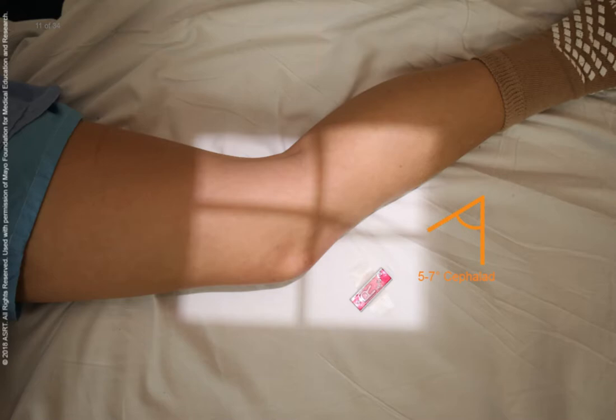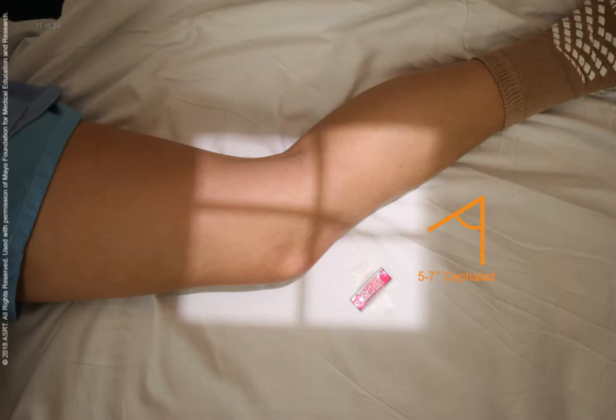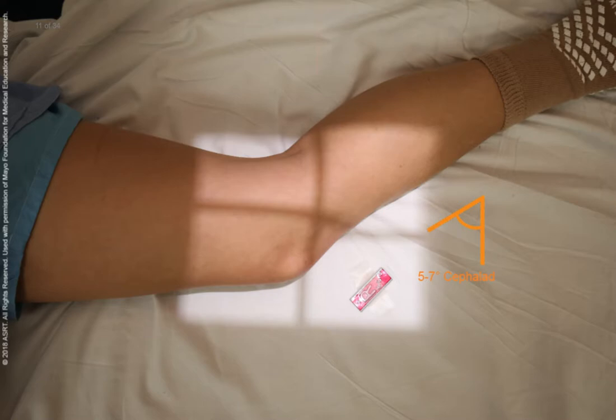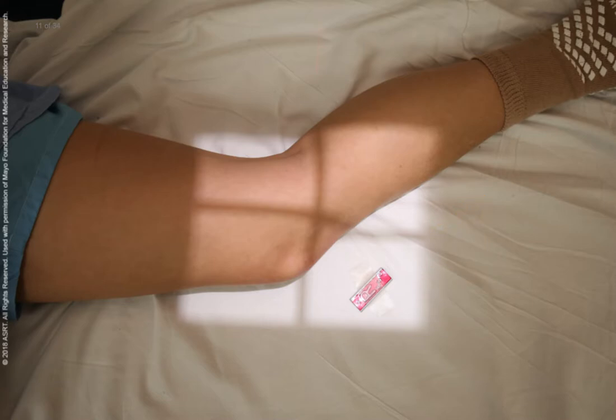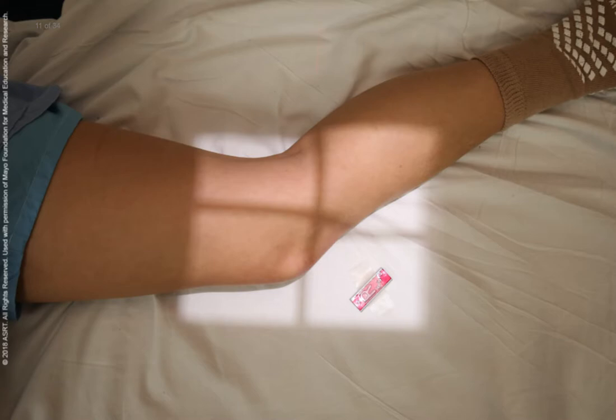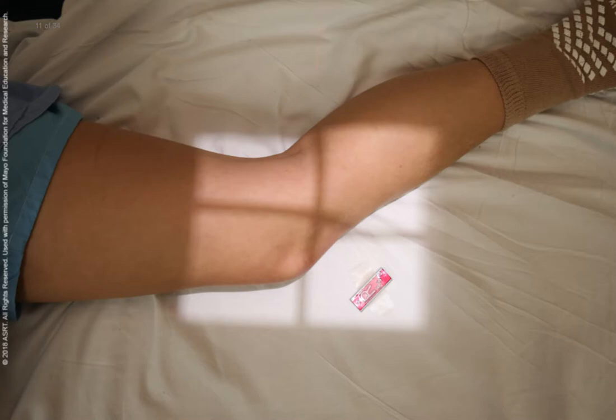The small cephalad angle is used to prevent the magnified image of the medial femoral condyle from obscuring the joint space. Also, the medial condyle lies slightly inferior to the lateral condyle when the patient is in a lateral recumbent position. Make sure the image receptor is centered to the central ray. Anatomical markers are placed on the image receptor to identify the anatomical side being examined. The patient's gonads are shielded and the shield is placed between the x-ray source and the patient. Instruct the patient to hold very still, but no breathing instructions are necessary.